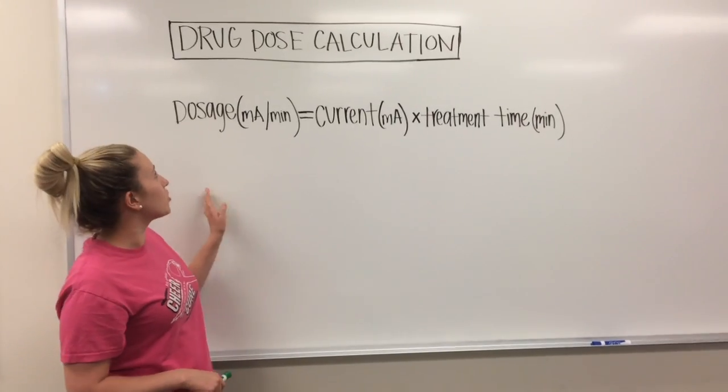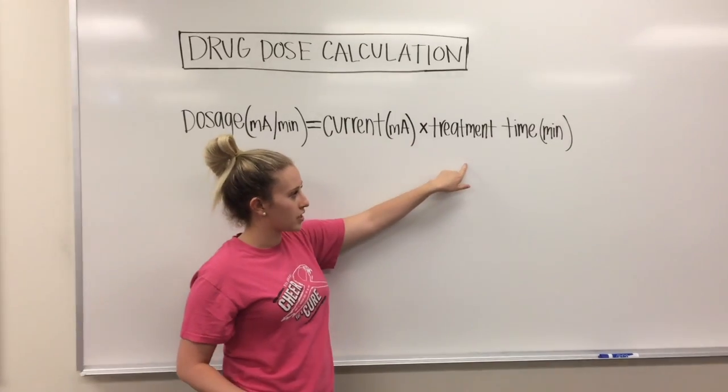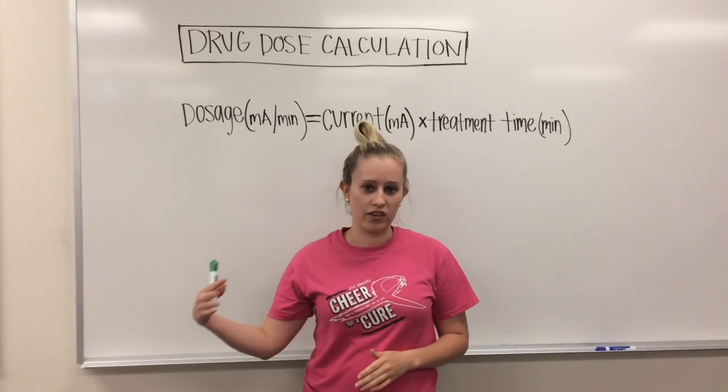The indications for iontophoresis will be different based on the medication you're administering. Those could range from anti-inflammatory to edema or scar tissue, or used for bacteria or fungus. So it really just depends on what your goal is and what medication is associated with it. As an overall indication, it's an alternative to a needle injection or taking a pill. For the drug dosage calculation, the dosage equals the current times the treatment time. We are going to show you a chart of all the medications used, their dosage, and the associated goal.